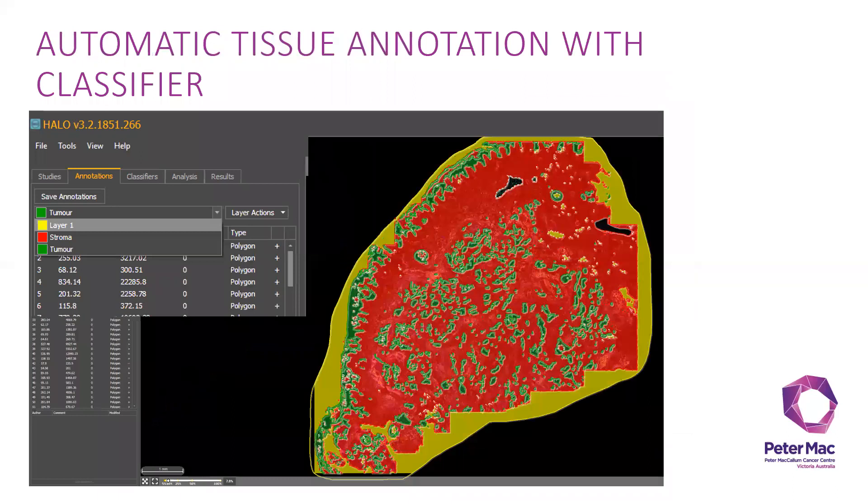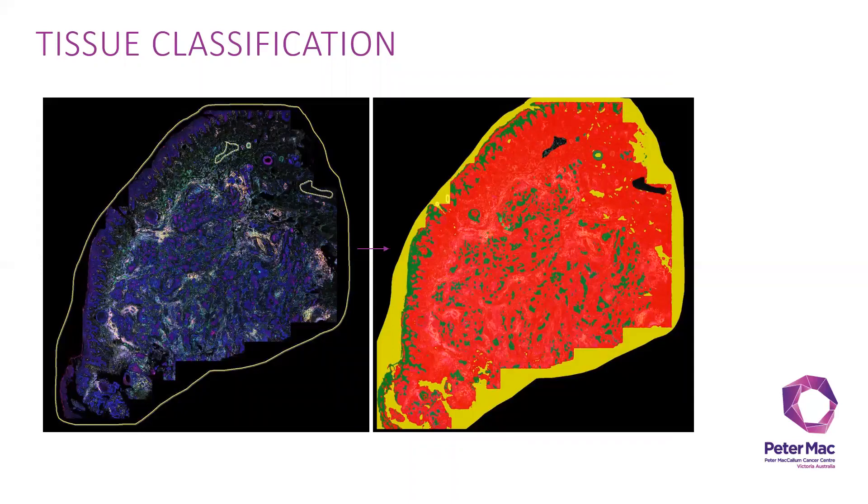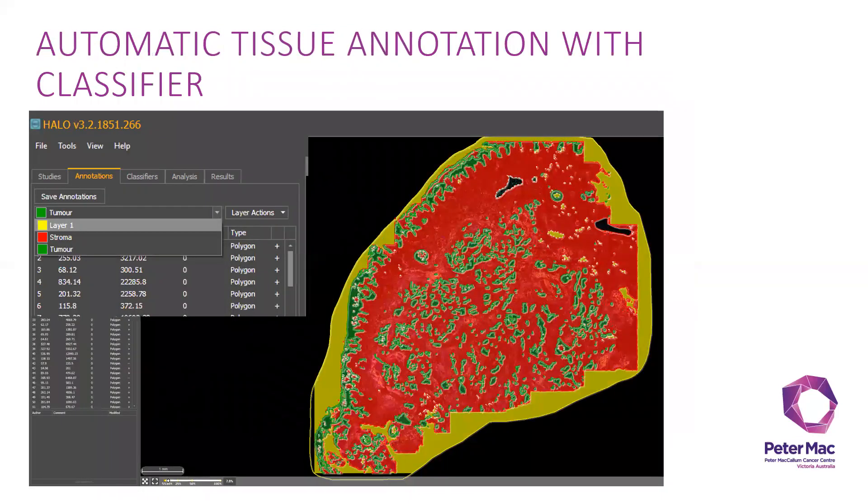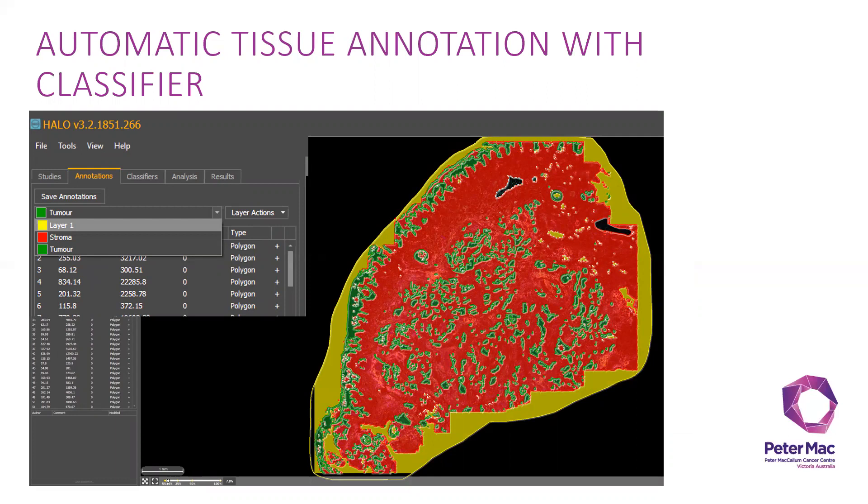From this step, you can then further use the automatic tissue annotation with classifier to actually turn the tumor and stroma into an annotation layer. This will come in handy when you are doing spatial analysis, which I will show later on during the presentation.